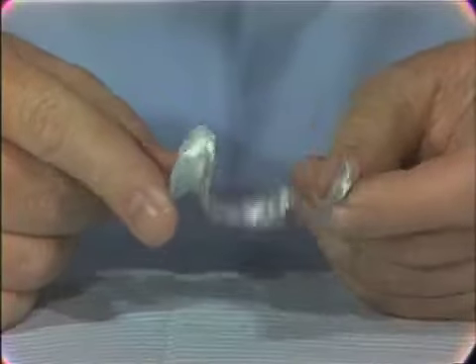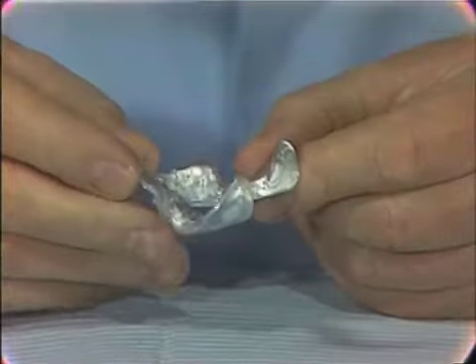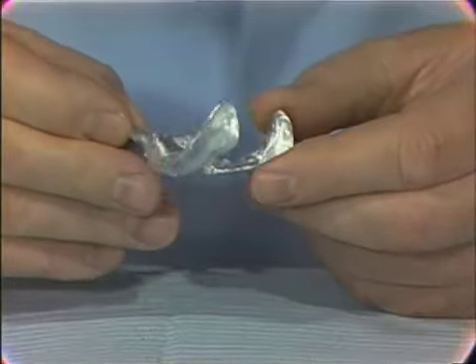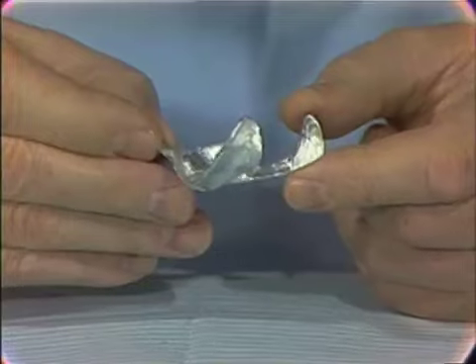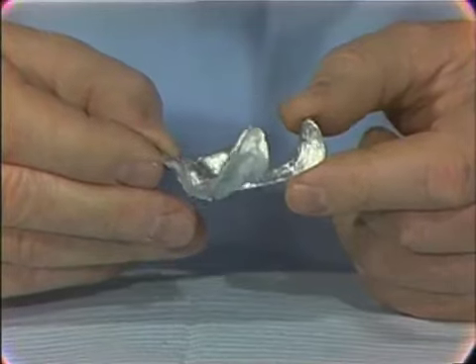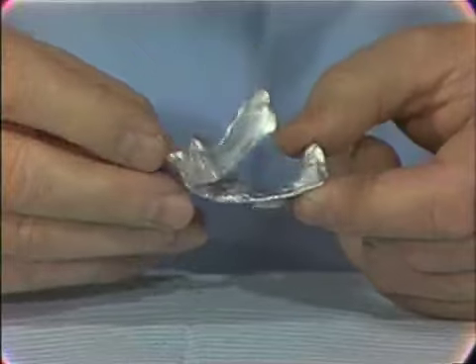If the tray is too bulky, it will distort the peripheral tissues. There should be adequate relief under the tray, between the tray and the ridge tissue, to allow the material to flow adequately without distortion of the tissue. If you take a real fluid material and force it into a restricted area, you will get hydraulic pressures, which could distort the tissue.